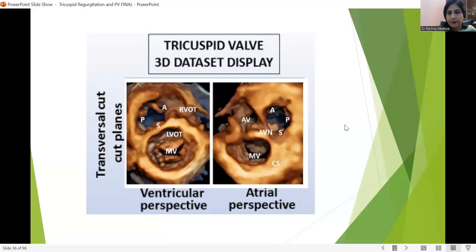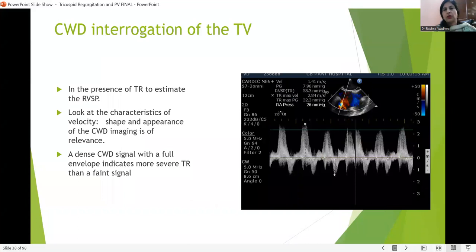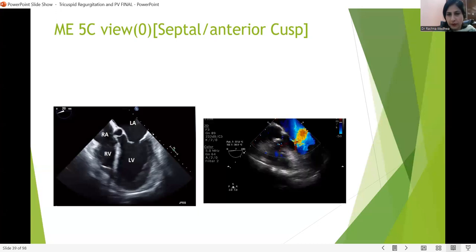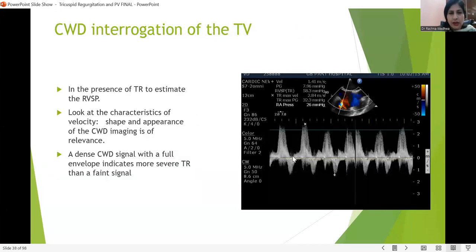If we want to measure the right ventricular systolic pressure in the presence of TR, the modified bicaval view provides the best Doppler alignment. Continuous wave Doppler gives us the peak gradient — if the velocity is 3 or 4 m/s, the gradient is 4V squared. We can also estimate RA pressures. What is important is the shape and density of the continuous wave signal: if the envelope goes straight up and is very dense, this indicates more severe TR.